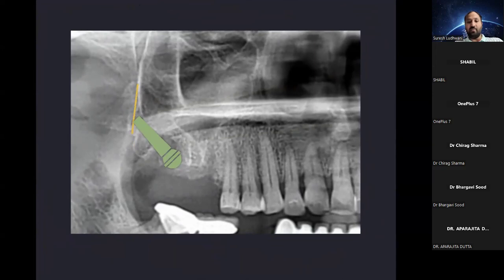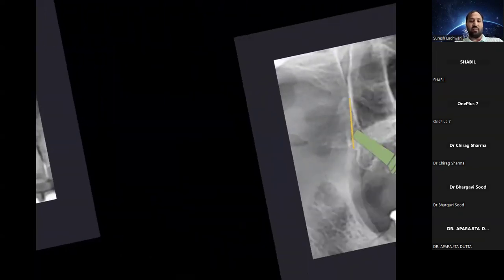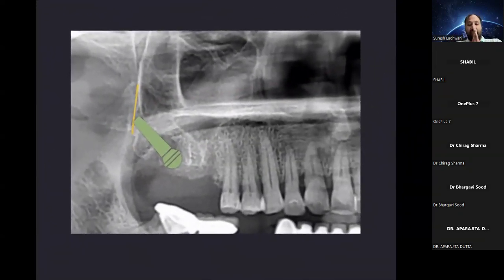This is the same triangle which I've shown. You can see it over here. I'll go back. Triangle, the same triangle you have to hit. Now, this is something which I want you to try, because this is very easy. I've emphasized a lot: three bones to remember, mark three bones.